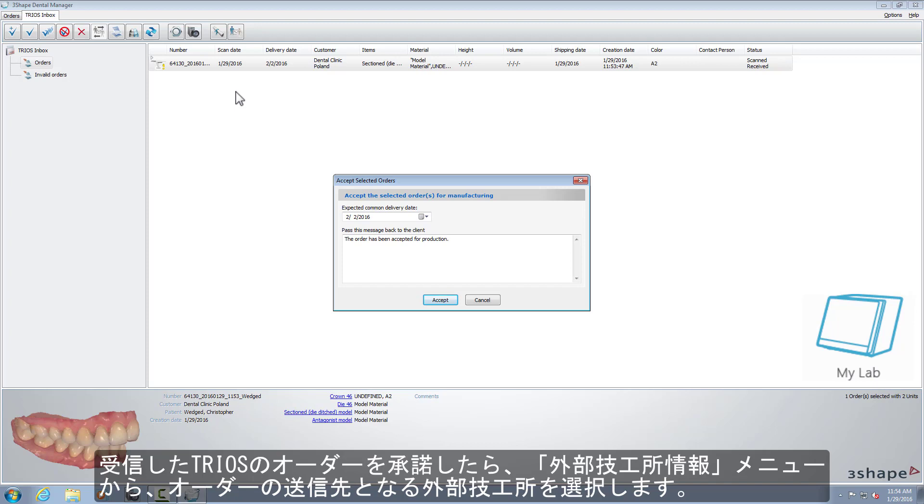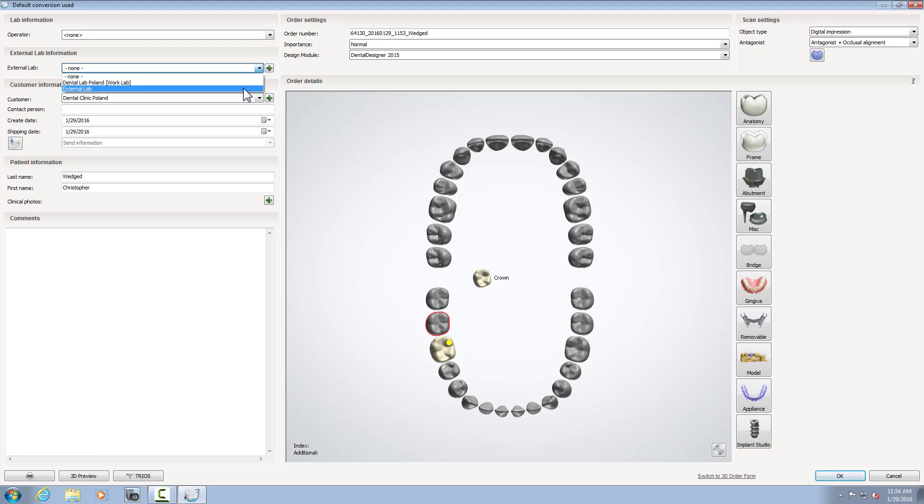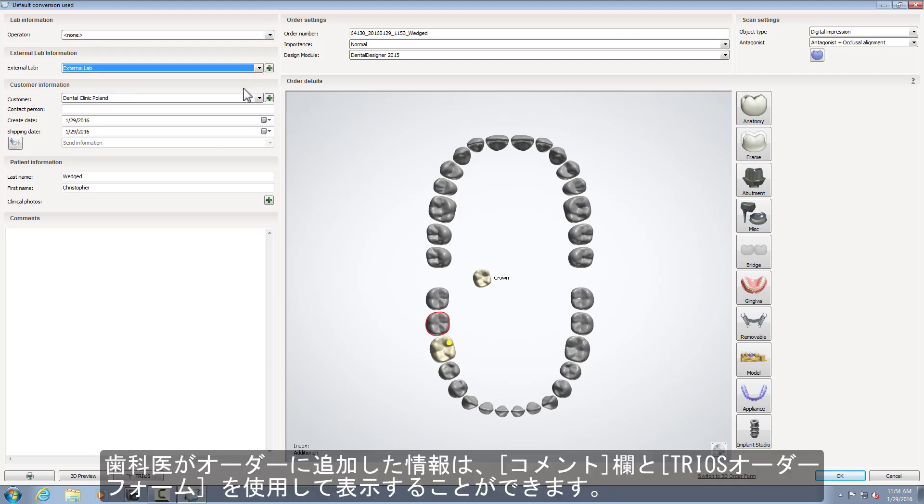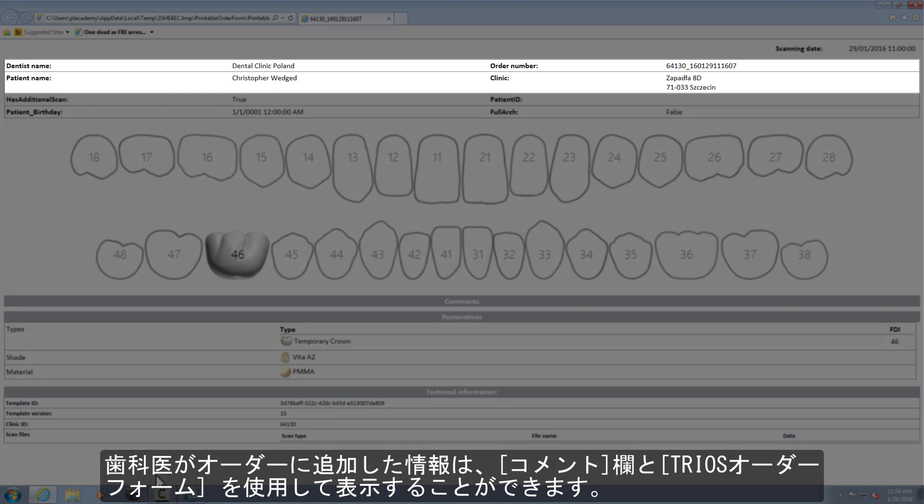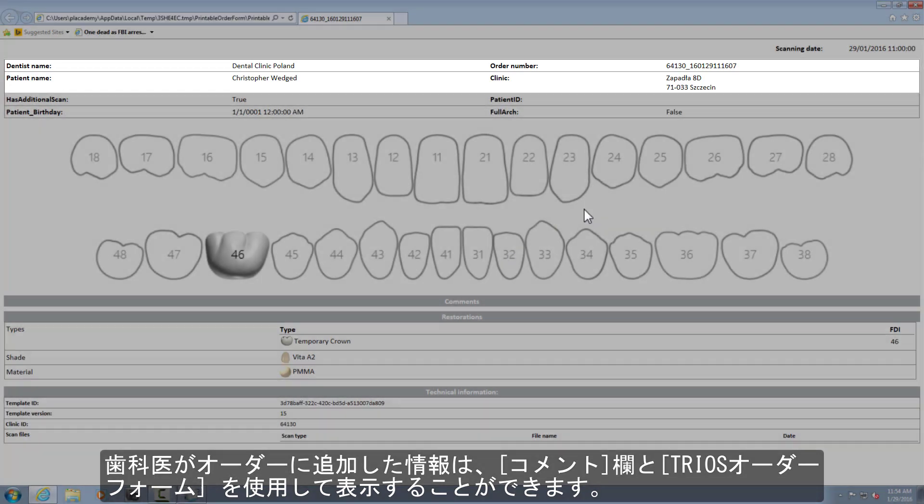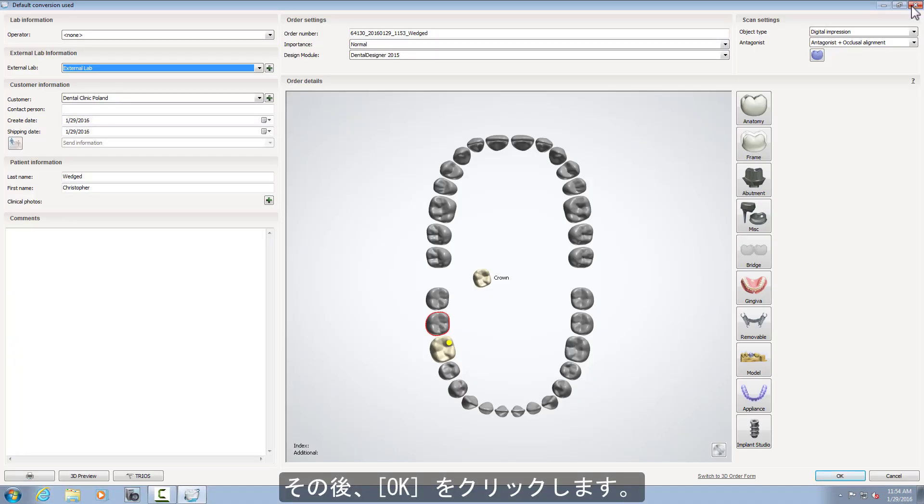After accepting a TRIOS order from the External Lab Information menu, choose an external lab to whom you want to send the order. Any information that dentists may have added to the order will be visible in the Comments field and through the TRIOS order form button. After that, click OK.